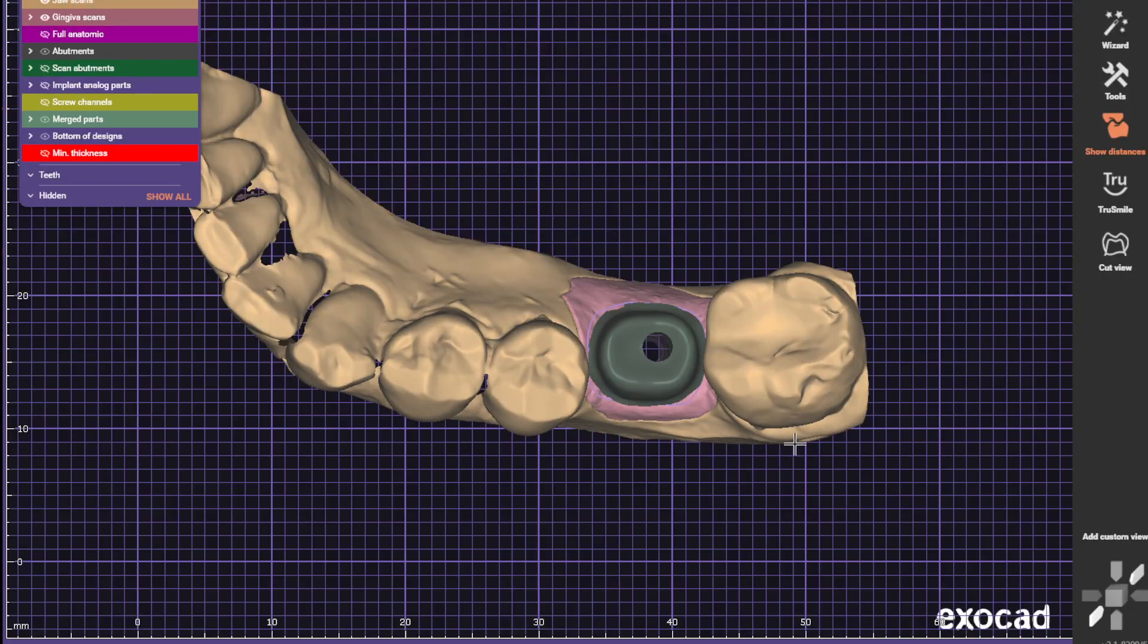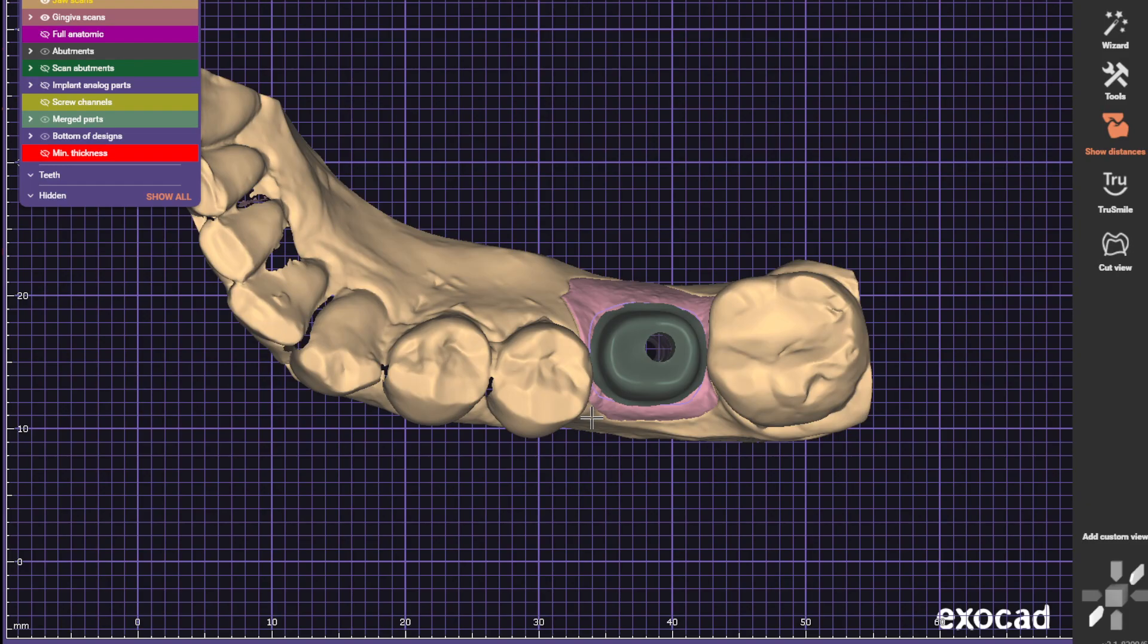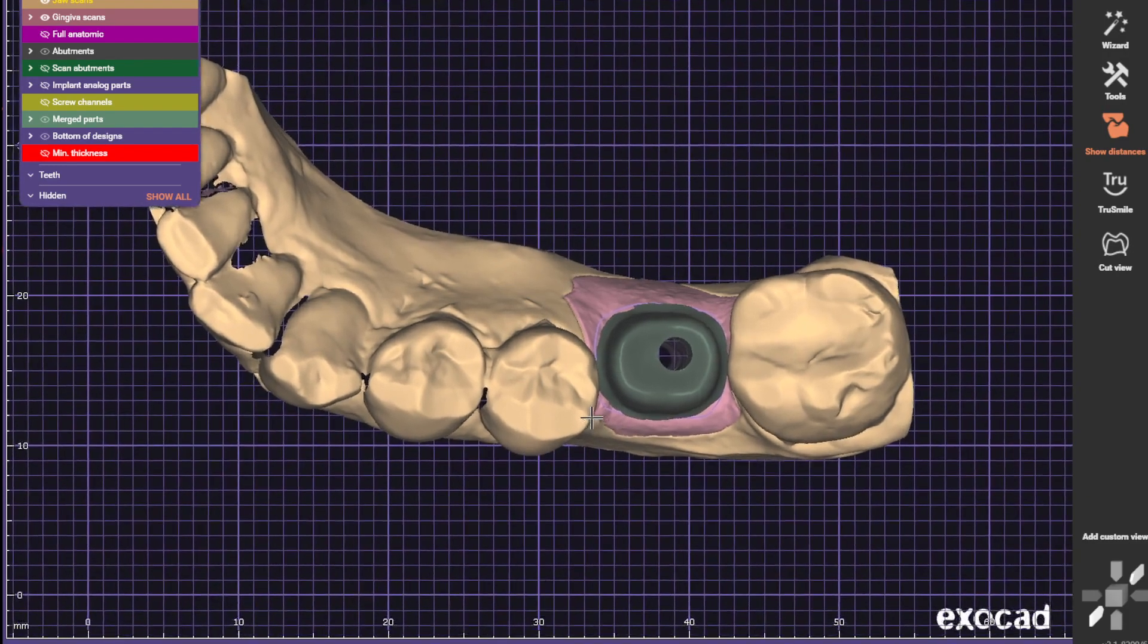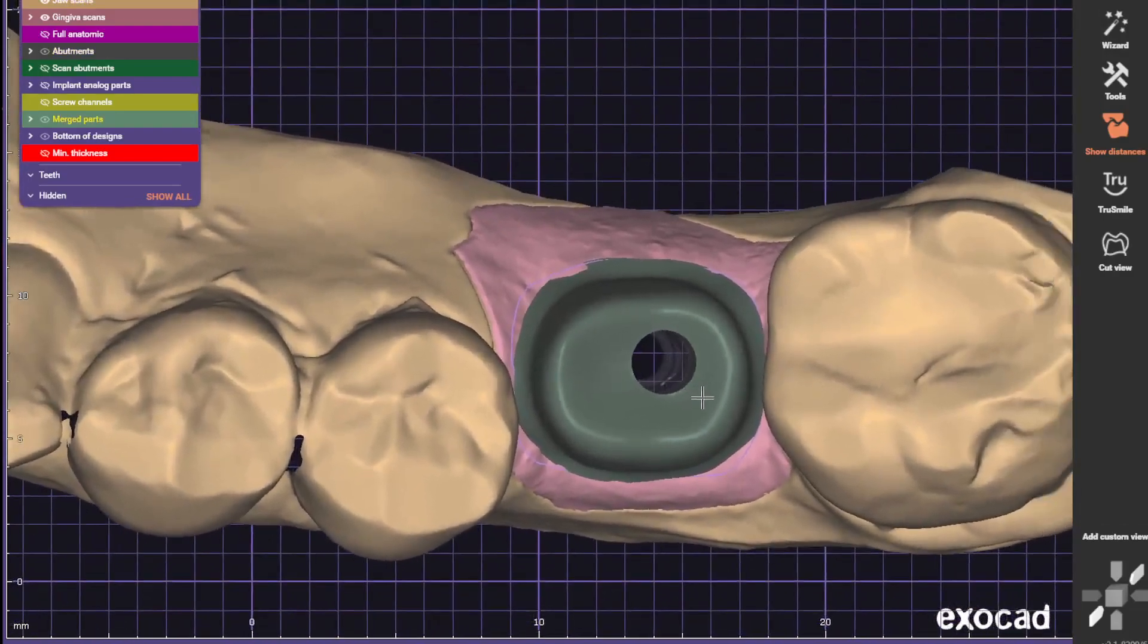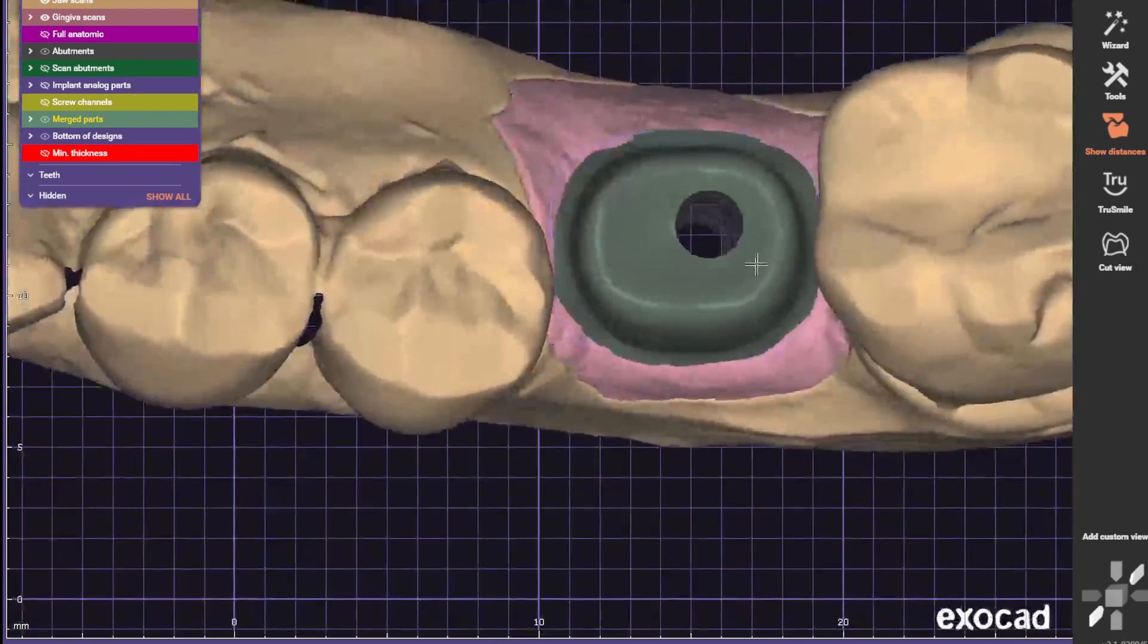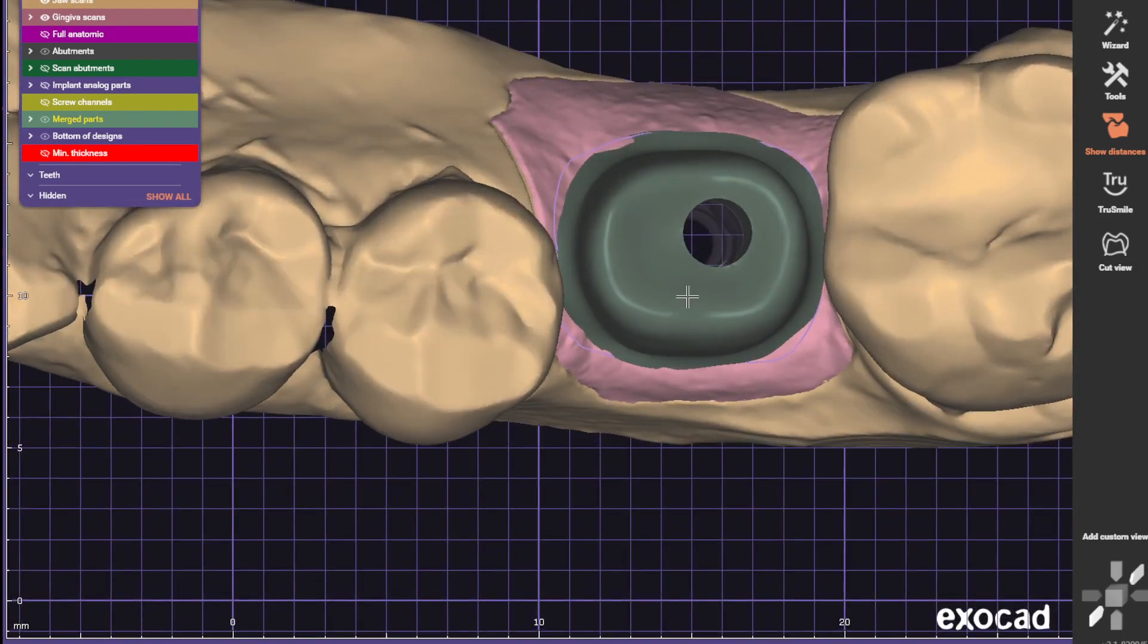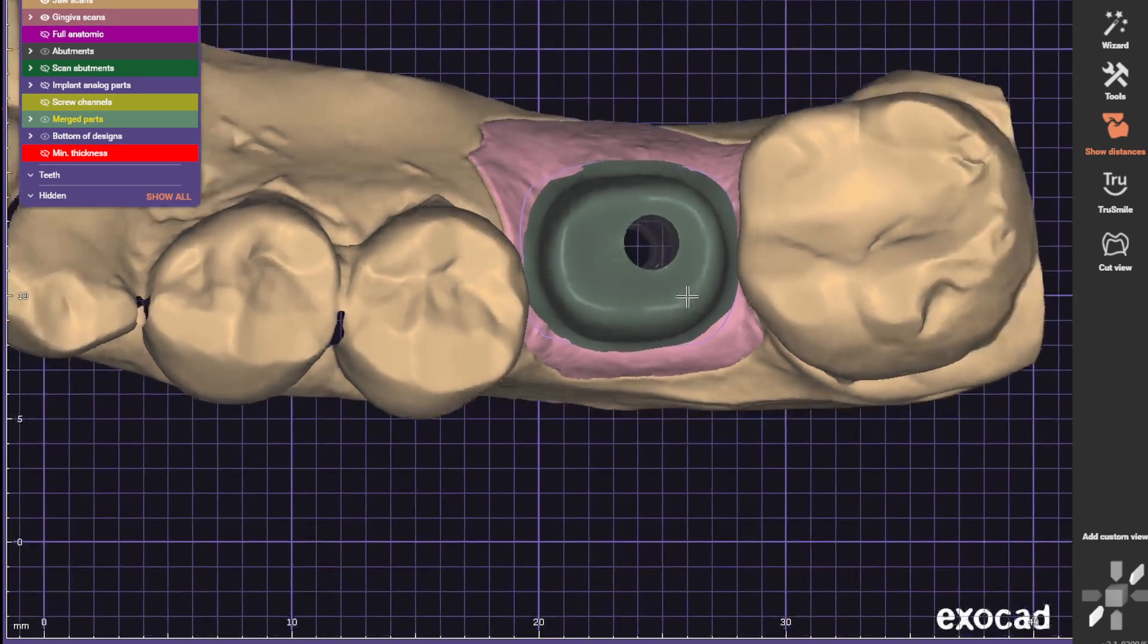Okay, here is the other one. We're gonna switch this also to screw retained. This abutment is too big—can't put the margin underneath the contact area, otherwise it's gonna be very difficult for them to even set the abutment in here.